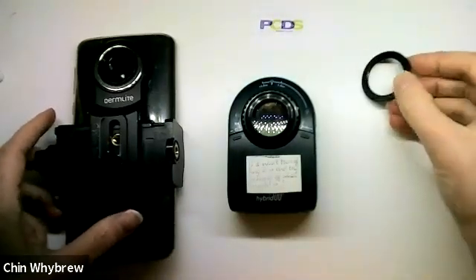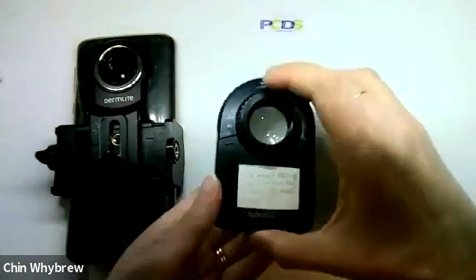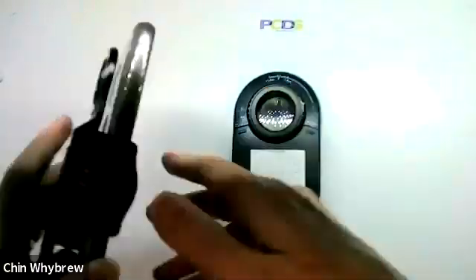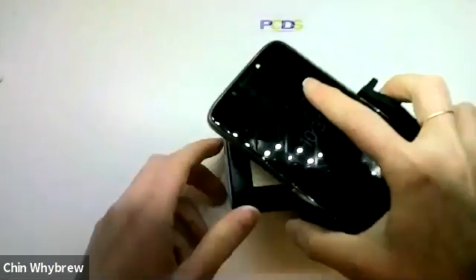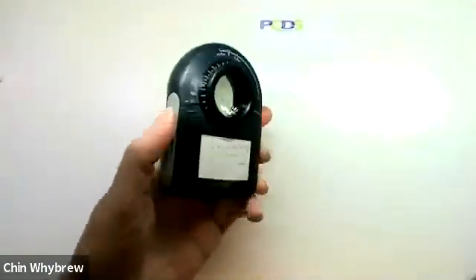...it comes with this magnetic ring as standard. This is the magnetic ring that just screws on so that we can now attach it to the phone with no difficulty at all.